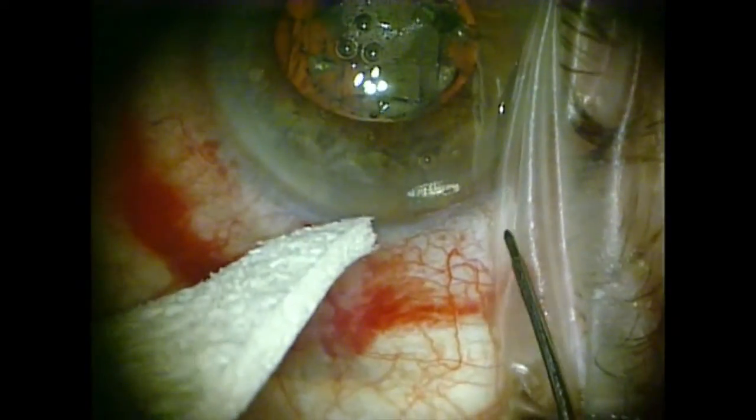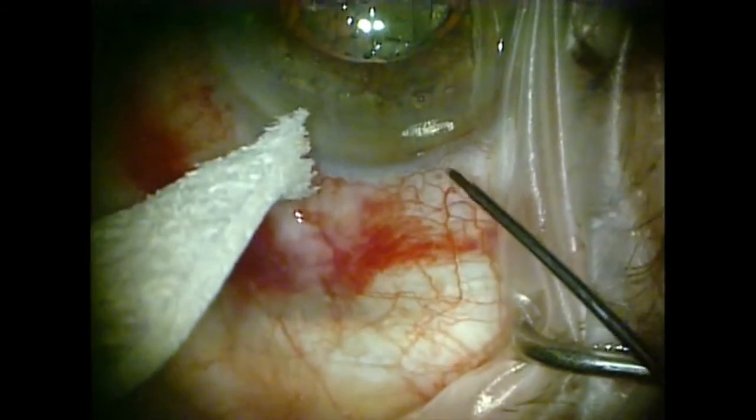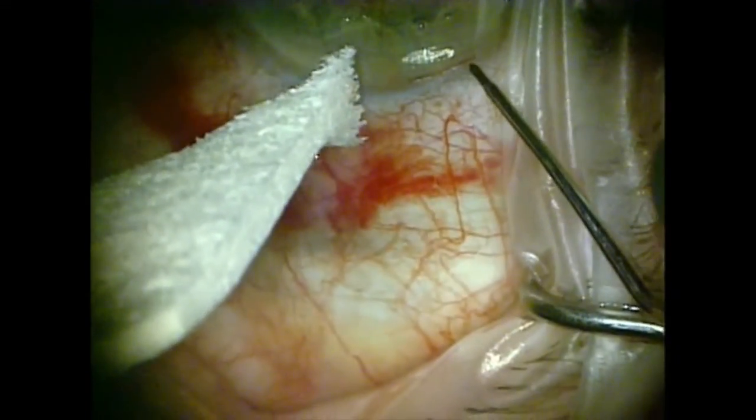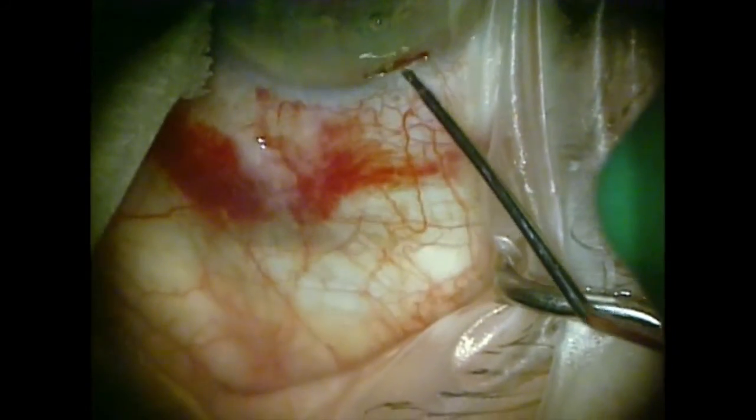Kind of took a still photo of it there to kind of show that. But on surgery, because we got it by OCT imaging, it's in the perfect position as shown here in this actual surgical video of that same case.